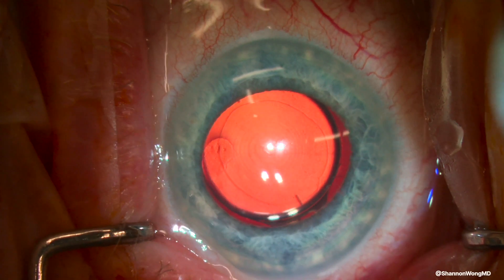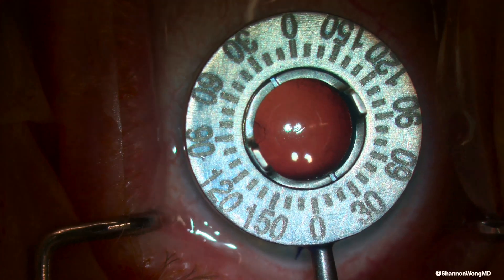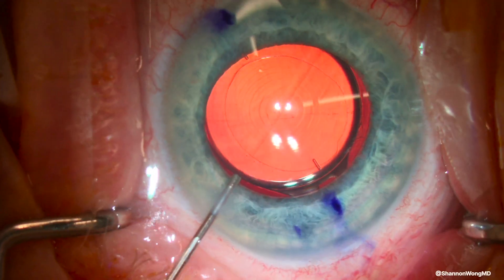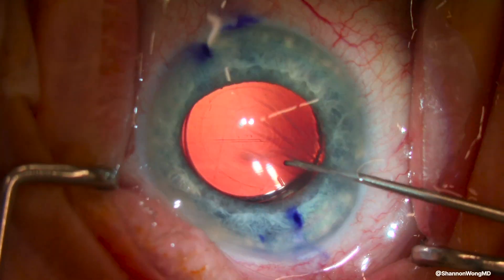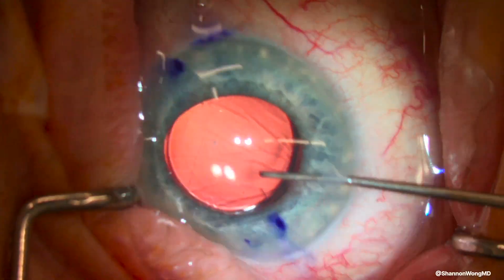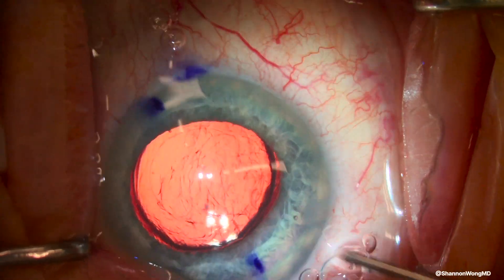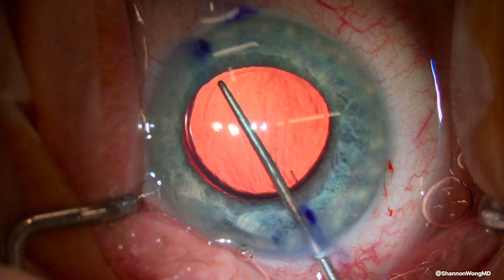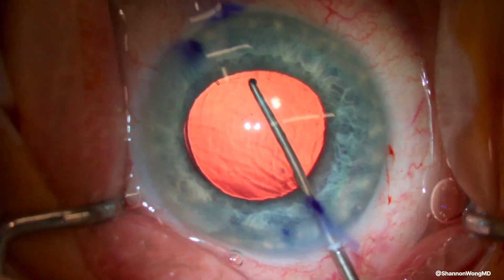Here's our patient during surgery. The eye is anesthetized with lidocaine and we use an axis marker to mark axis 26 degrees. The eye is filled with lidocaine anesthetic and a Sinski hook is used to try to rotate the NV multifocal lens into correct alignment. We're unable to rotate it, so we fill the eye with viscoelastic and again use the Sinski hook to try to rotate the lens clockwise, but are unable.